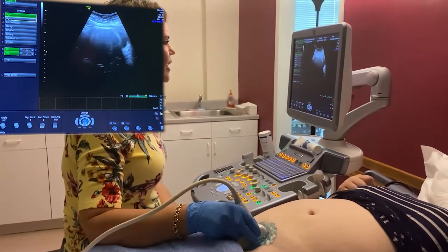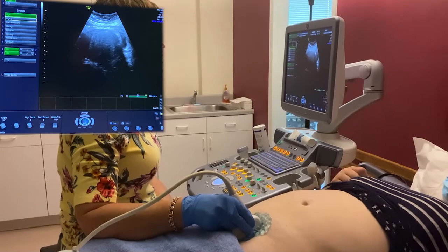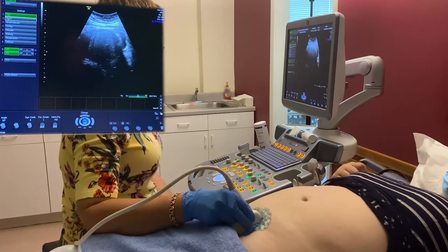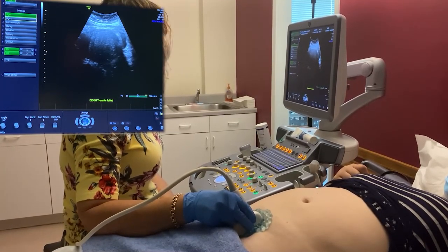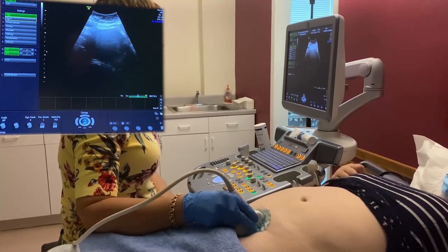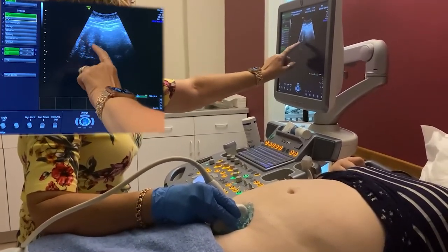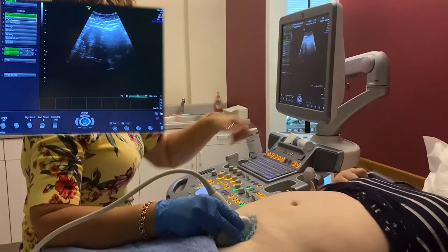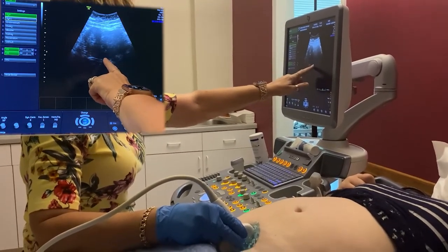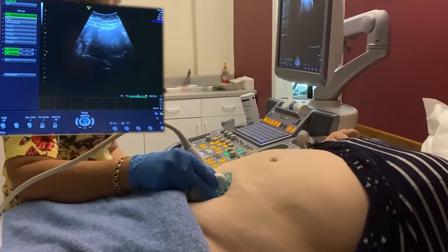So as I'm looking at this screen, I see right away that this patient's uterus is very heterogenic. It is of different and differing echo textures, which is leading me to believe initially that she may have multiple fibroids. I see several, one specific large one here, there's another one here. You can see the bright echogenic line, which represents her endometrium, and the posterior wall, which is down here, of her uterus.